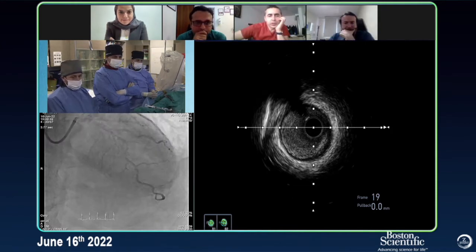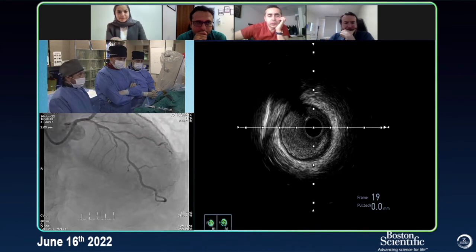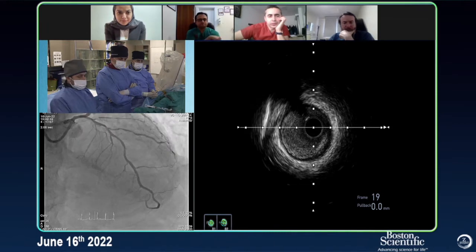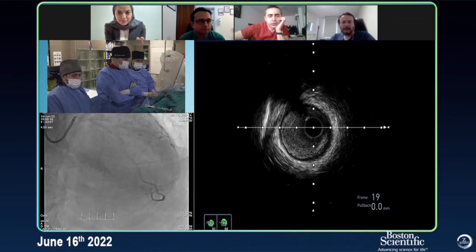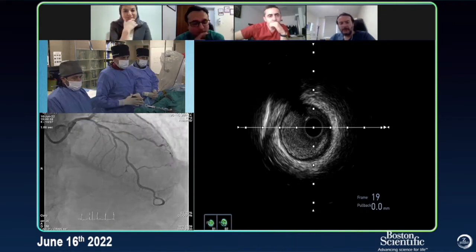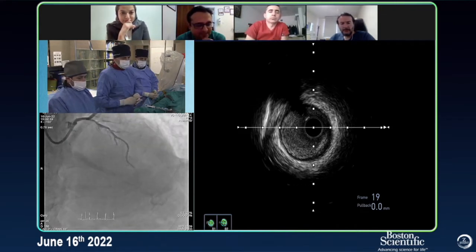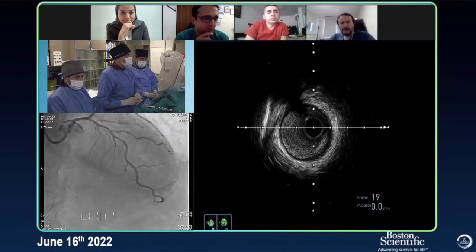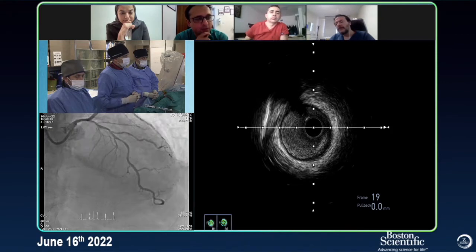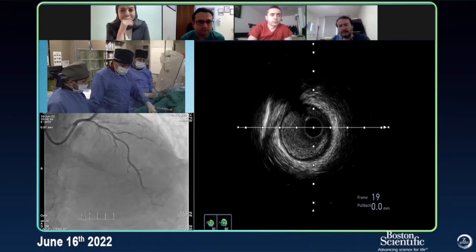Two options are reasonable: maybe balloon-jail technique for use with the circumflex ostium to prevent plaque shift. But crossing over the left main is the more reasonable technique. I think Rotablator is definitely needed upfront with all that calcium. What we see luckily is that most of the calcium is in the proximal and mid-segment, so we can size the Rotablator according to that part. Today we are using Rotablator Pro.